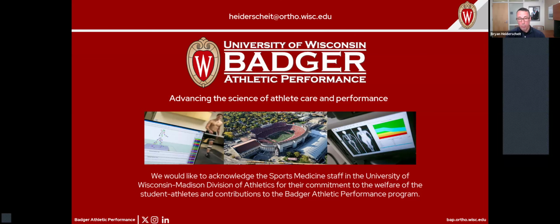Yeah, great question. So our plan is, we've captured pre-injury data as part of this particular research project. We will measure that again for individuals who sustain an ankle sprain, and then again as they get cleared to return to play and at various times throughout their rehab program. Lastly, the entire battery of individuals will have a repeat measure taken at the end of the season. So we'll get a sense of the demands of training on these individuals, because we'll have their training load data through Connexon, Catapult, or similar that will allow us to look at exposures. We'll look at training load on the individual athletes.